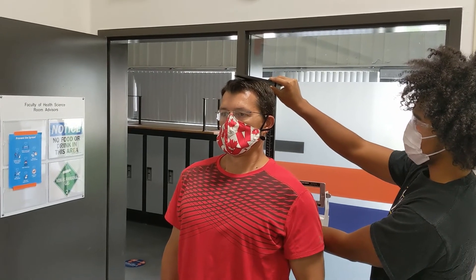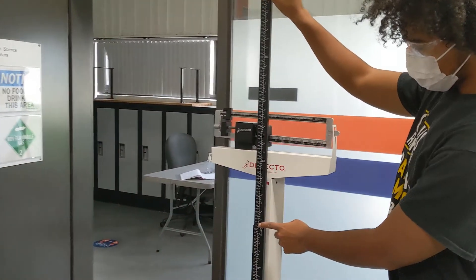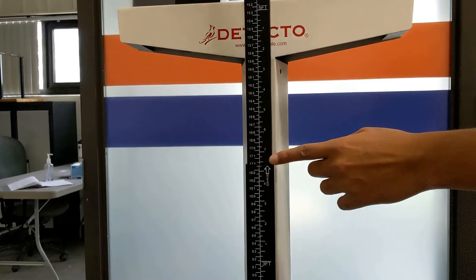Gently resting the perpendicular portion on top of their head, have them take a deep breath and step away. As you support the scale, you can then take your reading to the nearest half centimeter. You can see here that our final reading was 172 centimeters.